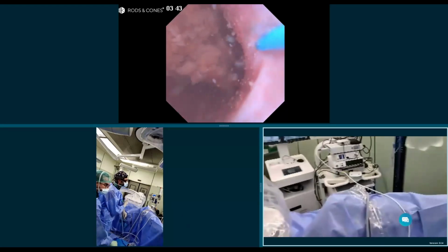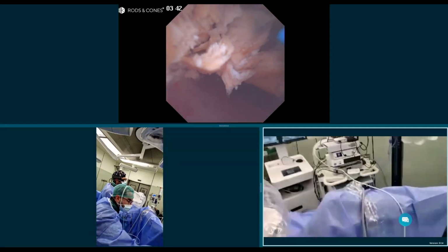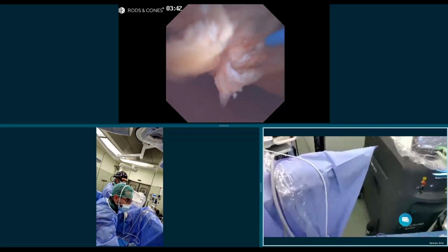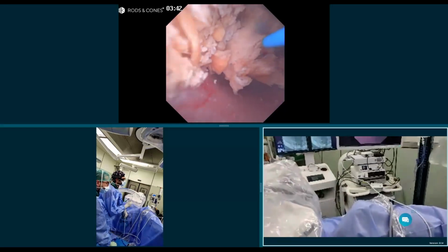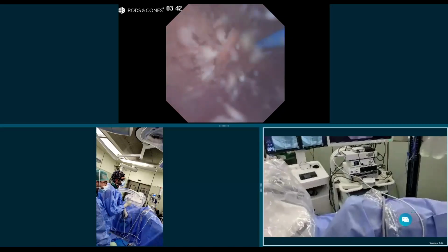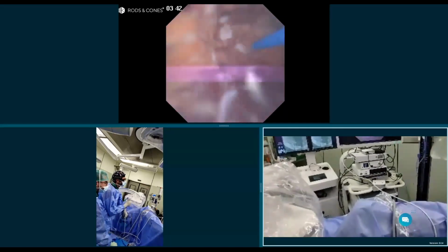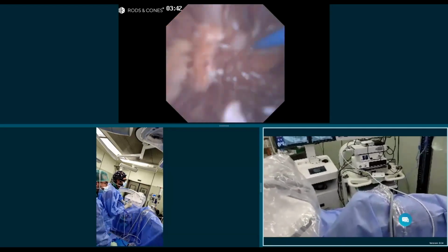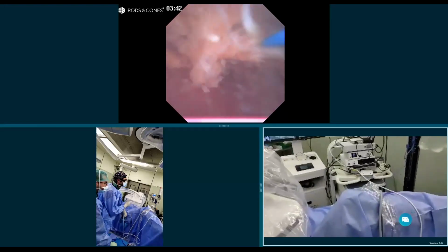¿Me puedes subir a uno, por favor? Gracias. So I was saying that it was a little bit difficult to dust. I'm going to use 1 joule, 20 hertz, so 20 watts. This will increase my power for popcorning. This is my maximum power setting. And this will make a good popcorning.